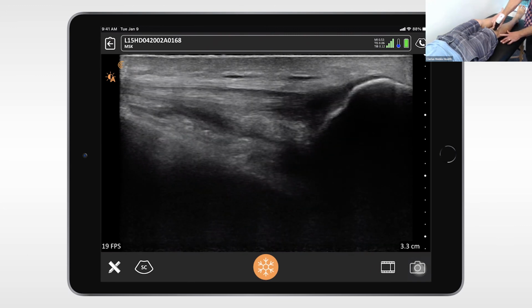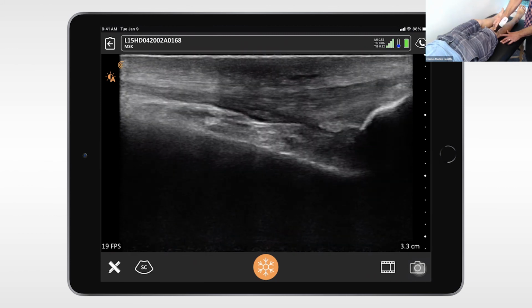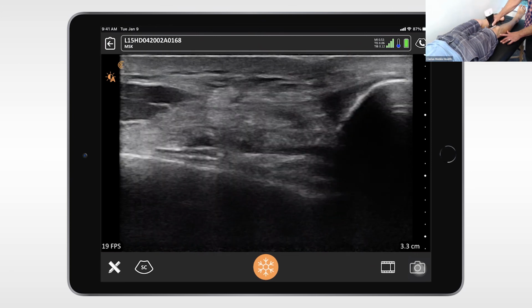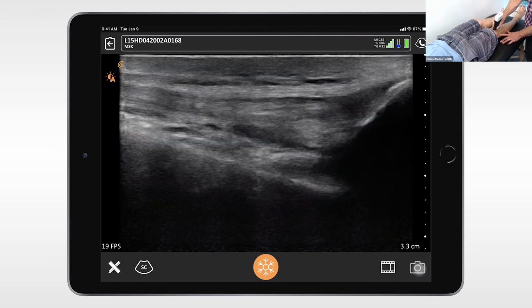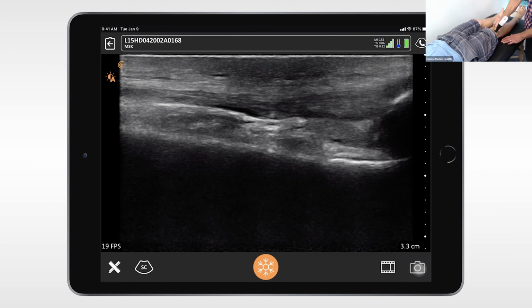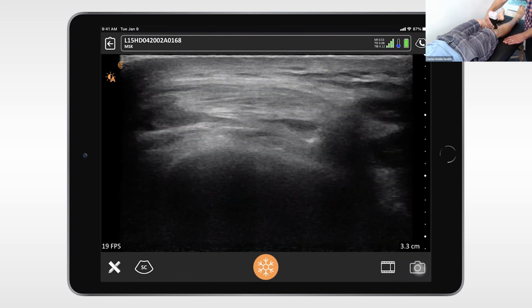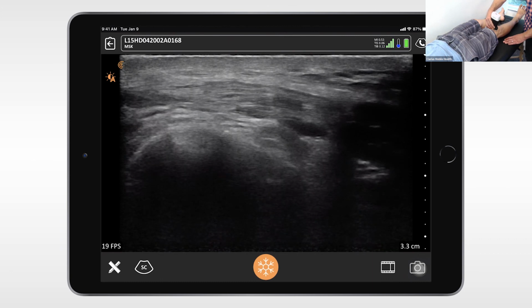Yes. And then you fan over the tendon from lateral to medial, right? You're making sure, like you mentioned, to get the whole tendon all the way across. Yeah, it's important to scan the whole region, not to forget places, and look at the integrity of the quadriceps tendon, but also at the amount of fluid collection, or what's inside the fluid collection, because sometimes you can also see some synovial proliferation or some loose bodies right there. Right, so there's maybe a trace effusion in the suprapatellar bursa right there. Yeah, okay, and then always making sure we go in axial, in the short axis, scanning through. Yeah, great. Fantastic. A little bit of fluid.